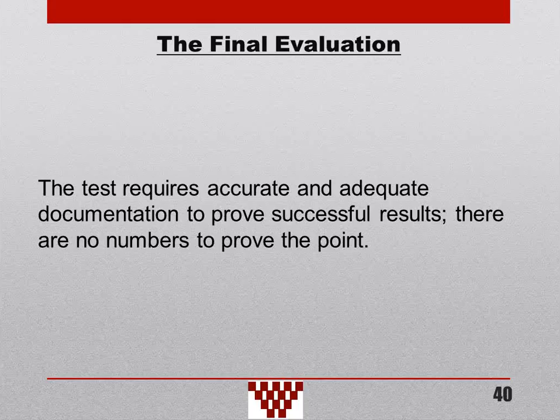Again, the final test requires the accurate and adequate documentation to prove successful results. Remember, there's no numbers here, so the report winds up being the document by which you can prove successful completion of this procedure and therefore an adequate package design process.